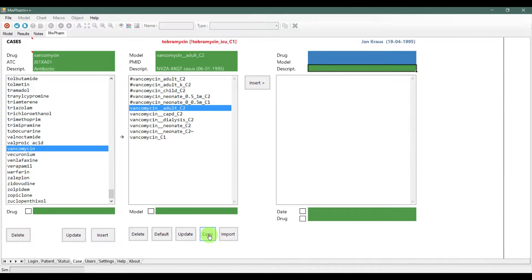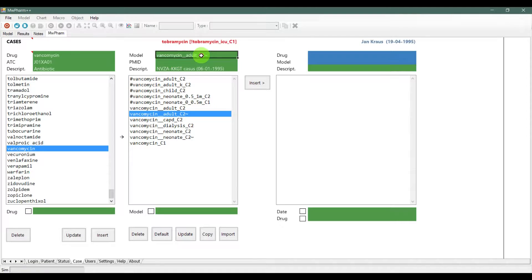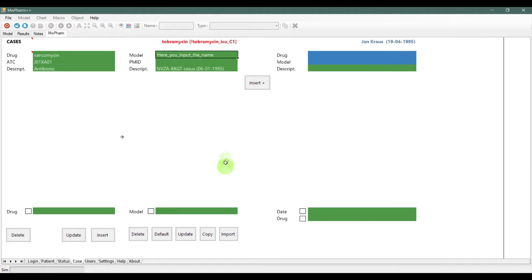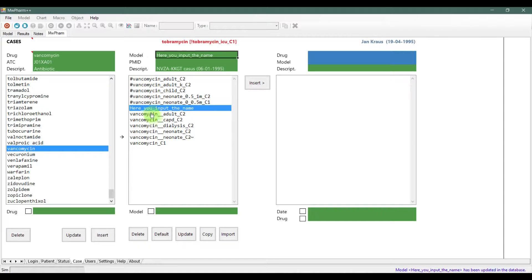If you want to make any change to the model, we recommend copying the model, so you always have the model you changed it from. To rename the copied model, input the new name here and click update. You can also delete or import models. To add the model to your patient, click the insert button.